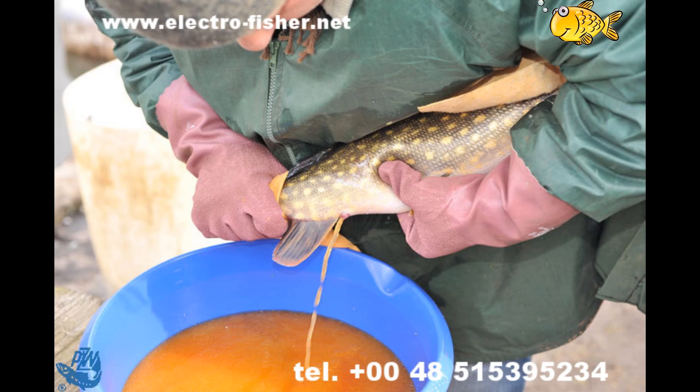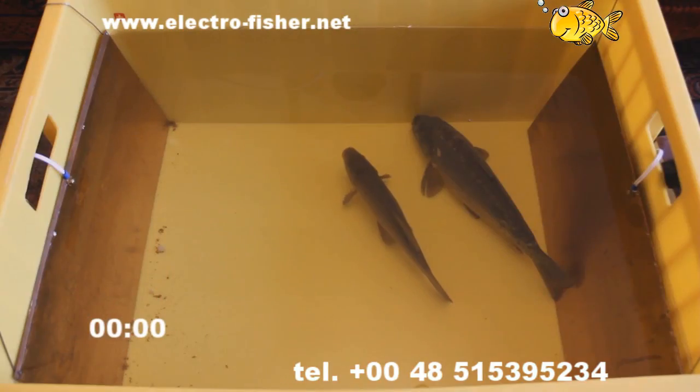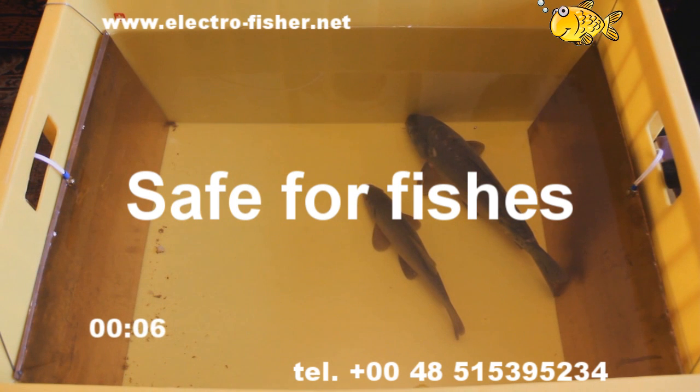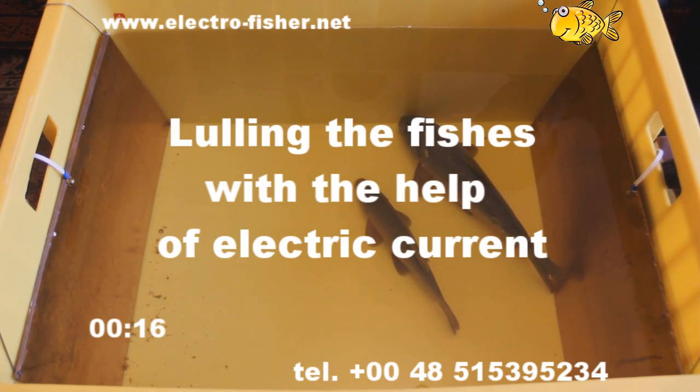Very often in the industrial fish production process it is necessary to stun fish, especially when acquiring eggs and milk from spawners. The presented device effectively helps in artificial reproduction. It fully replaces chemical compounds for fish anaesthesia. Properly selected electric parameters are 100% safe for fishes.